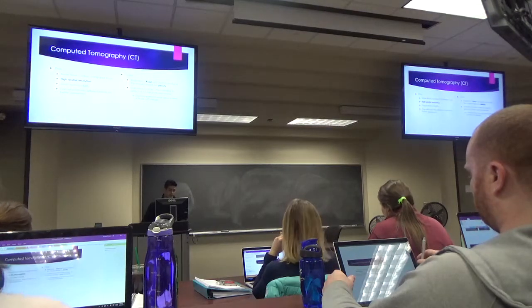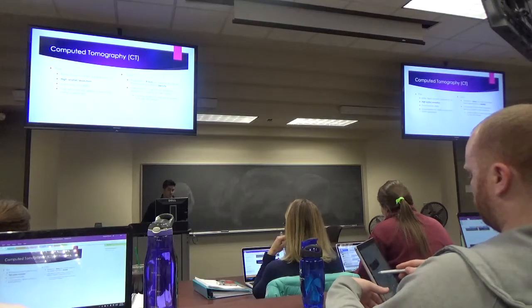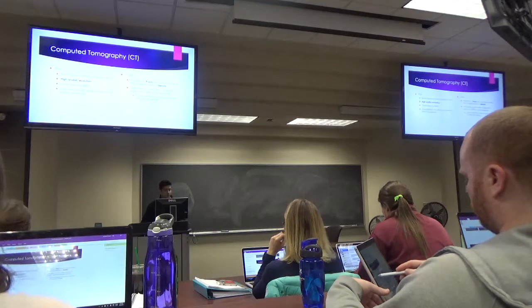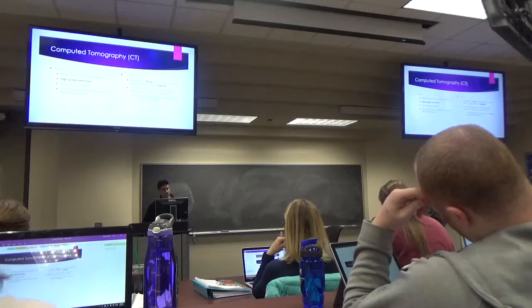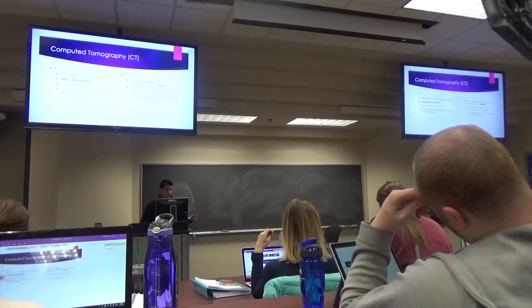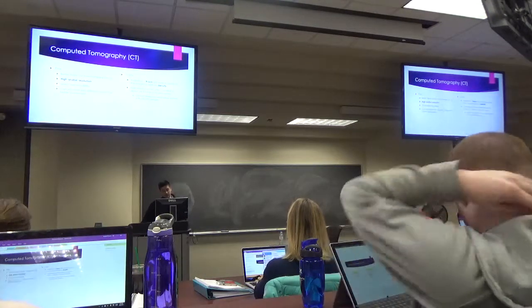3D picture. It does give us better tissue contrast when we compare it to ultrasound. It does have high spatial resolution, which is going to be very important when we compare it to MRI. It does have great reproducibility. Basically, all the tech needs to do is enter the parameters, and then they just send the patient into the scanner, and then the scanner does everything it needs to. And then we can also reformat things in different planes.